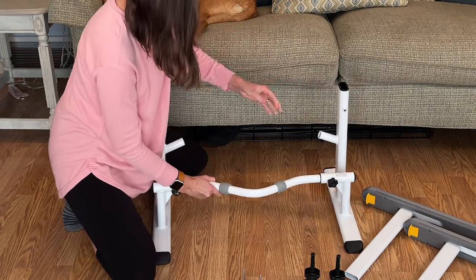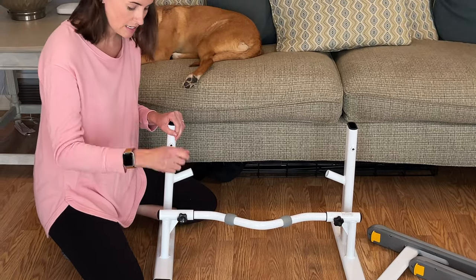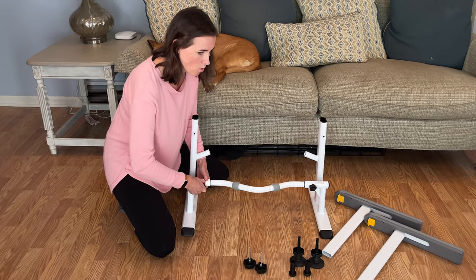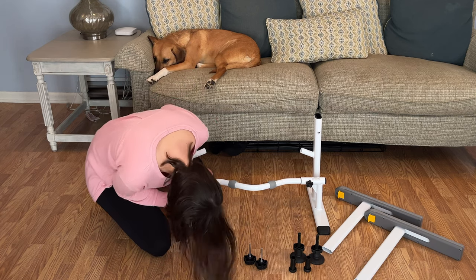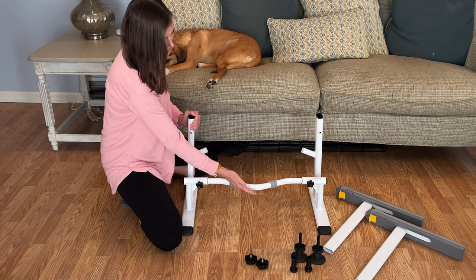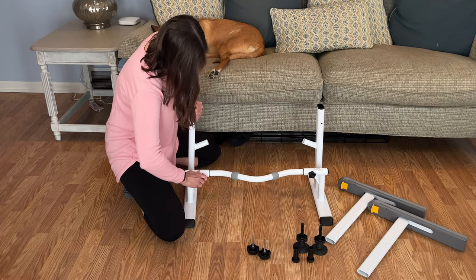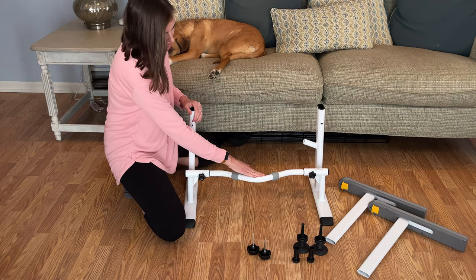So now that that's assembled — something important to note: there are two sets of holes. If you put it in the wrong set, it won't lay flat. I actually put this one in the wrong hole, so I'm going to unscrew it and lay it flat. There's an angle that you can put this at — you can put it in either hole depending on the type of toilet base you have. I have a straight toilet base so I don't need it on an angle, but if certain toilets have kind of an angled base, this can be angled as well.